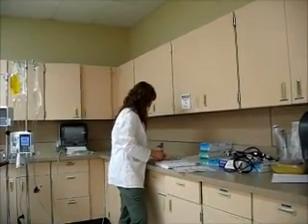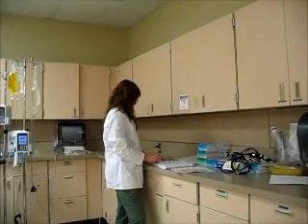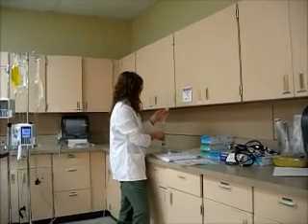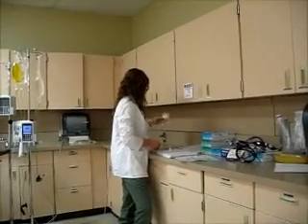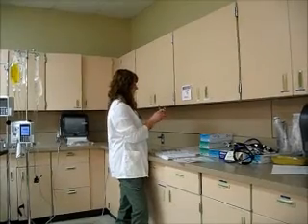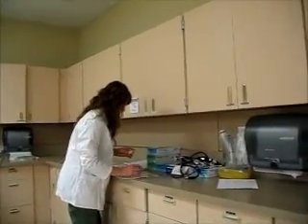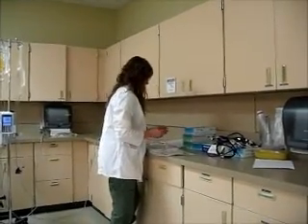First, actually, I am going to draw up my insulin and put it in my syringe to give the bolus. I'm also going to take my regular insulin, and I have 100 units in 100 milliliters, and I'm going to prime my bag, or my tubing. And then I'm going to draw up; I have 100 units in this vial. I'm going to be comparing this with my order. So I need 8 units.